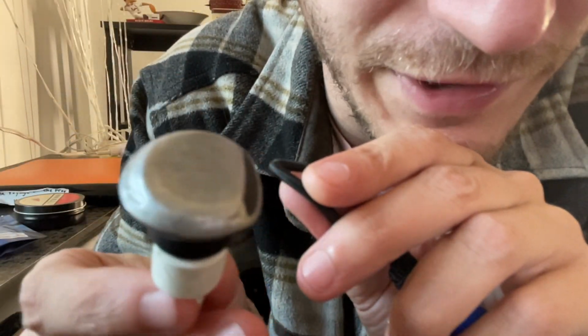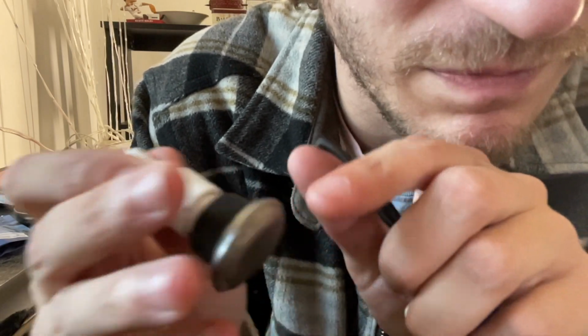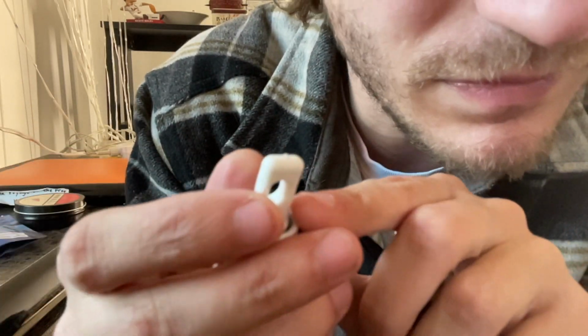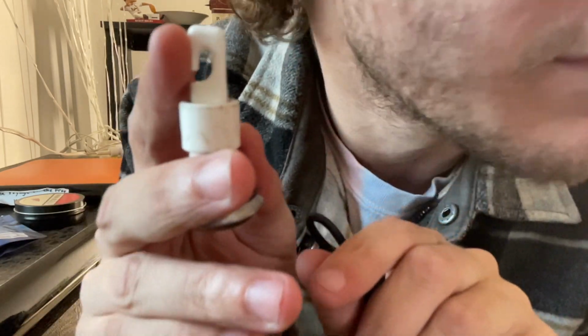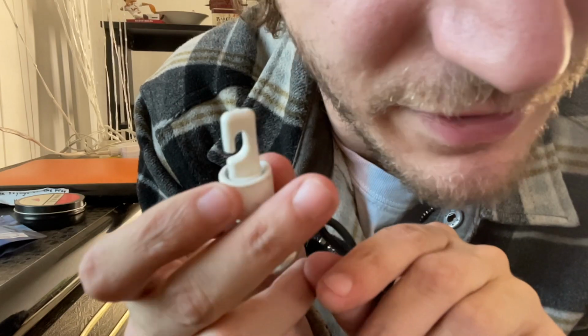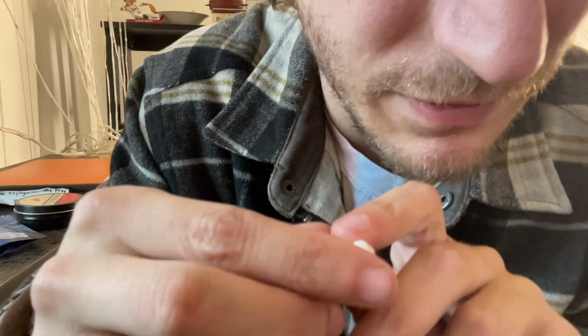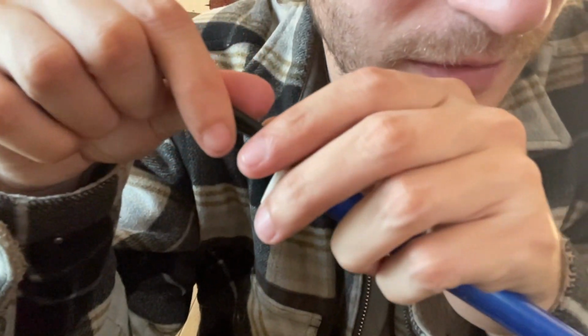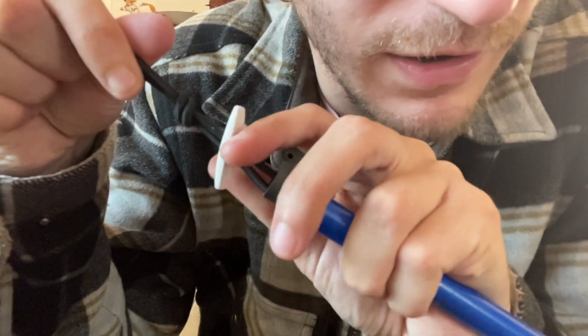So if this was an old nasty boy, which it is, but it's not unusable, so I shall keep it for now. But it has a hook piece on it here. I'm hoping I'm getting that on camera. I'll just rotate it around, and that hook then hooks right back on. If this were now a new tip, I could hook it back in, pull this out, adjust the little T-shaped dude.